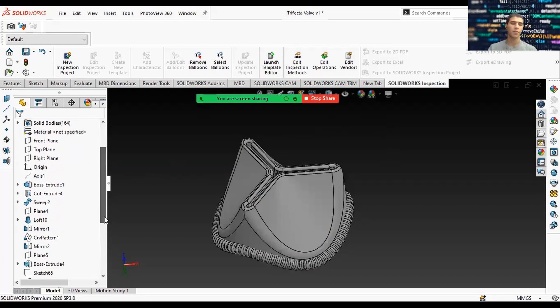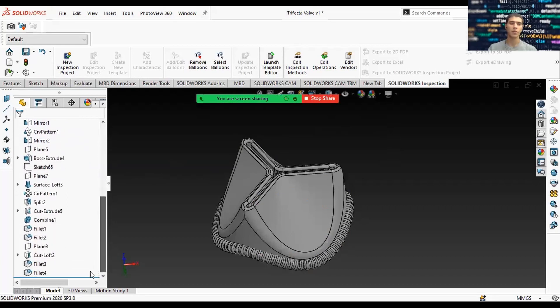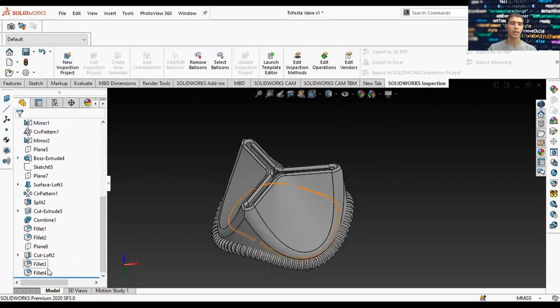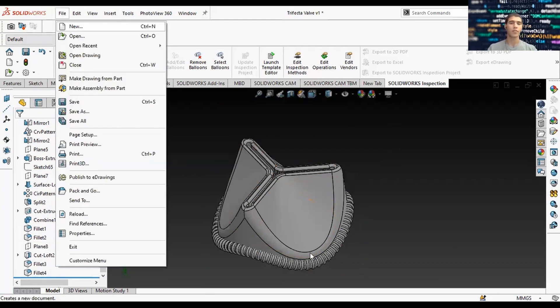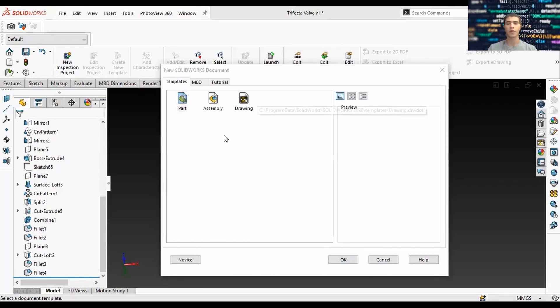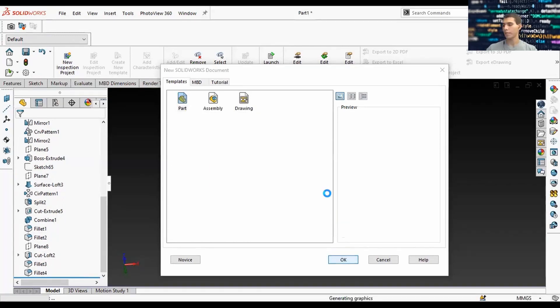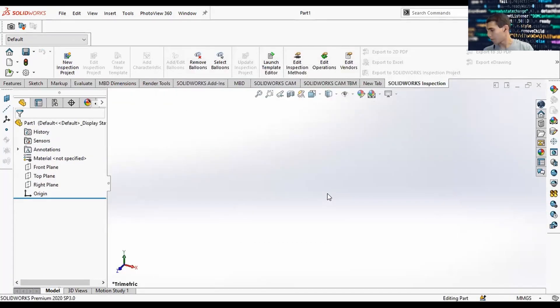This feature tree will allow you to see the progression of the part as it's being made, from the earliest to the latest features incorporated. The first thing you want to do is start a new part.